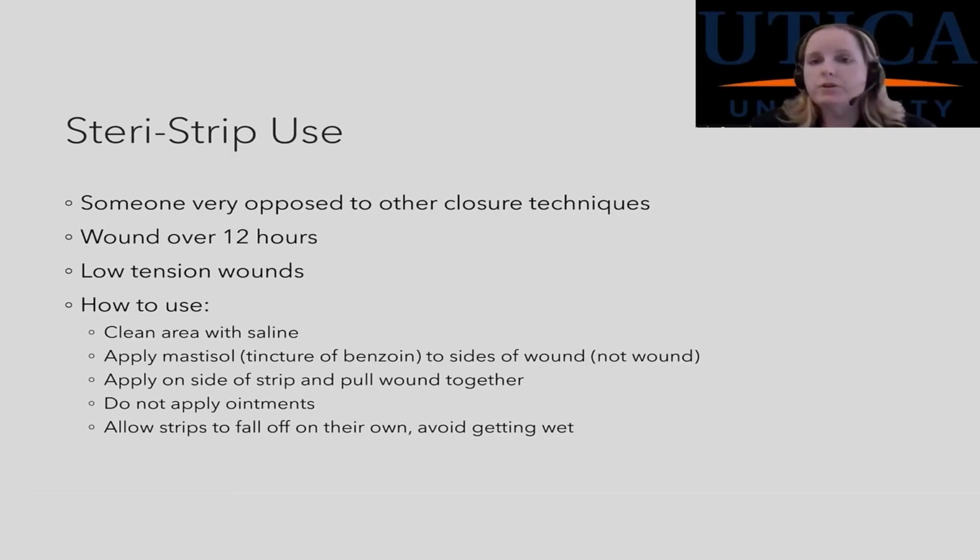Steri-strips. So when do you use it? Somebody who's very, very opposed to other closure techniques. If the wound is over 12 hours old, you can use Steri-strips. Okay. It also has to be low tension wounds, because if it's a high tension wound, these are like never going to work. They're not going to stay. They're just going to come off, because like these are not like the strongest.